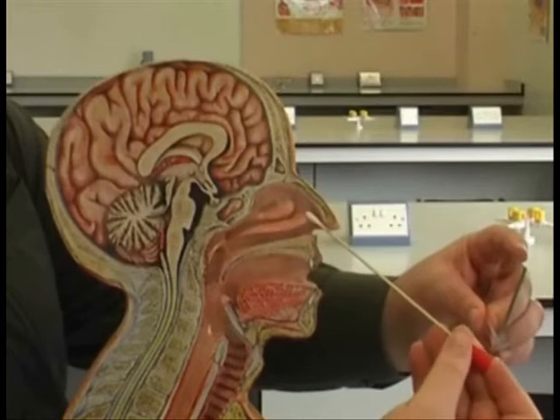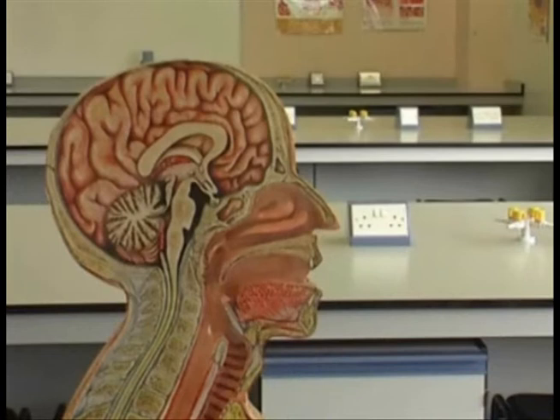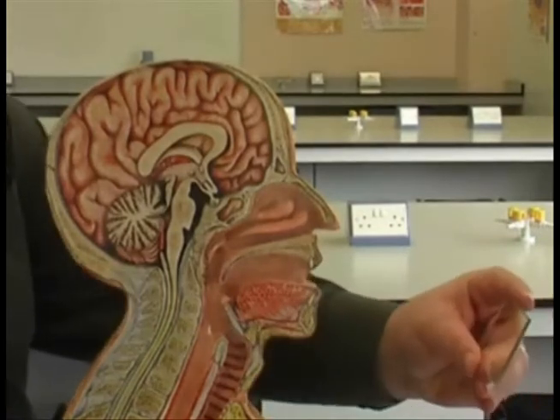Secondly, nasal swabs should be taken with the swab entering parallel to the palate. With a twisting motion, collect your sample. Be careful not to go too far up the nose as this may cause discomfort.